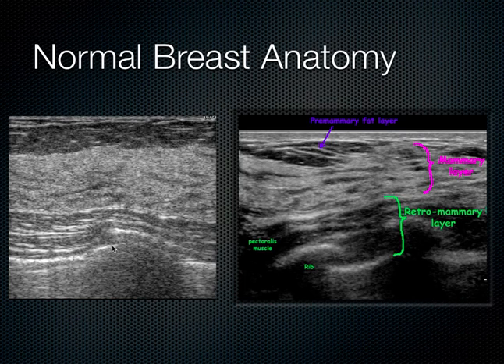This is a rib right here with the shadow coming down, which I know you're all used to from looking at all that lung ultrasound. And so therefore, if this is the rib, what do you suppose this white line over here is, and then this white line over here is? That's right, this is the pleural line. Exactly. So that's what you'd see if the patient's breathing in and out. You would see this pleural line sliding back and forth.